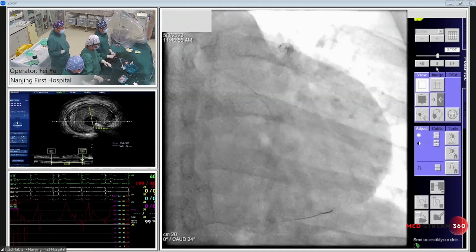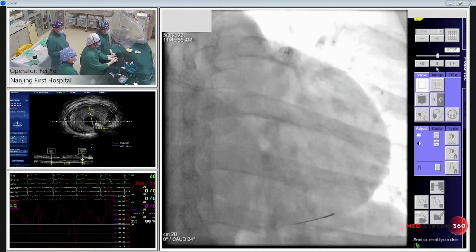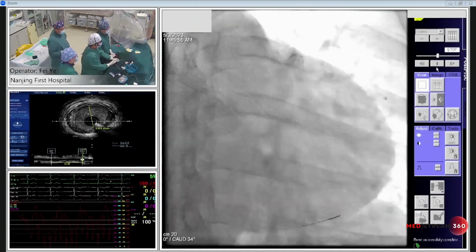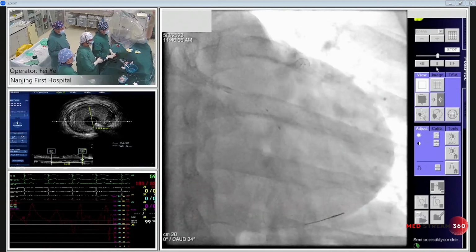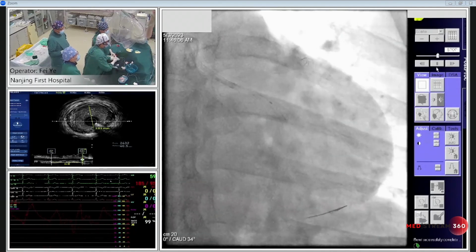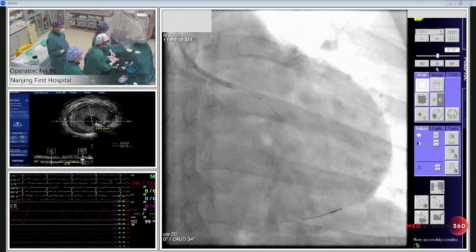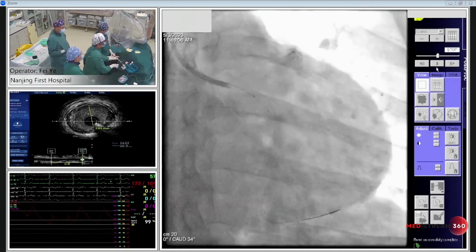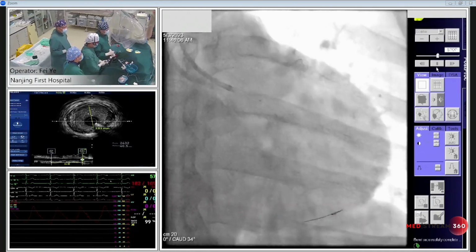The POT is very important. Just as Dr. Ye mentioned, we should avoid the distal edge of the POT balloon extending into the carina. Otherwise, we will cause the carina shift again, especially for this very difficult access, the wide angle bifurcation. Now the back test. I think POT is very important, using a special POT balloon.